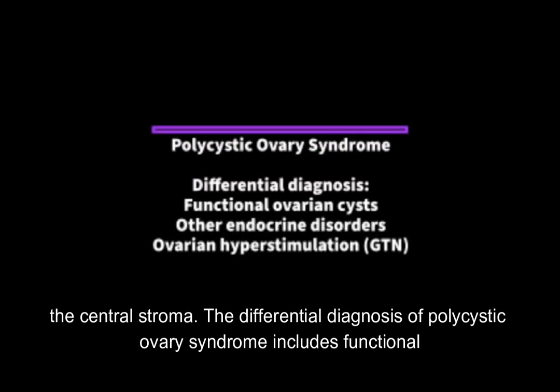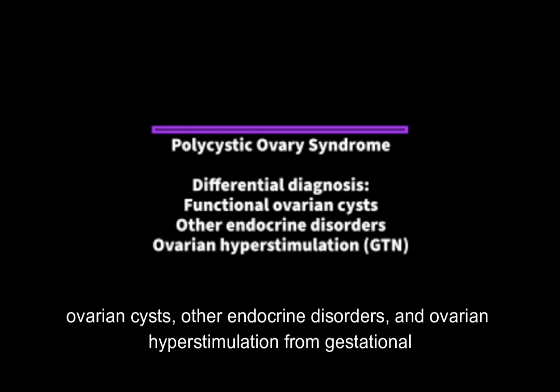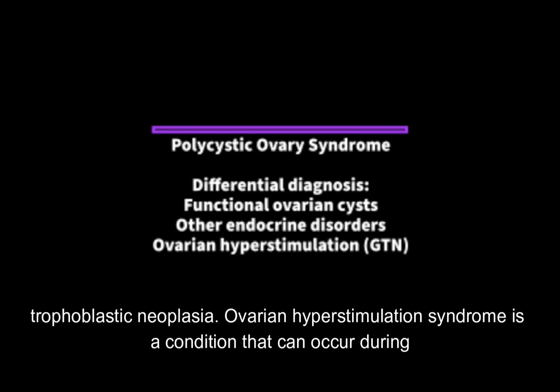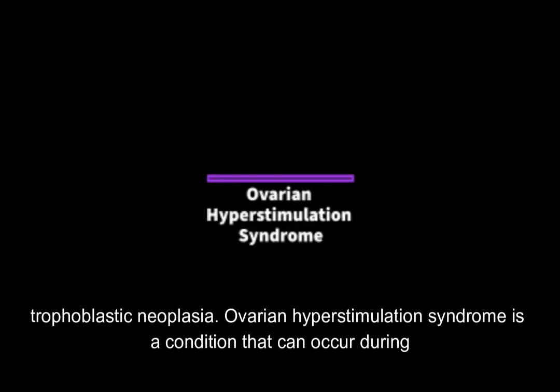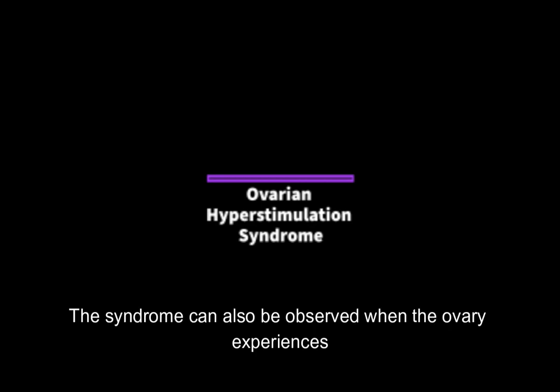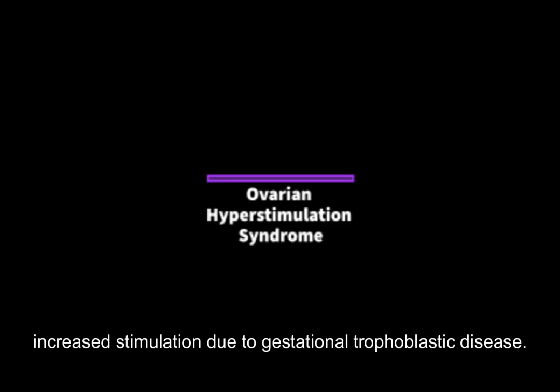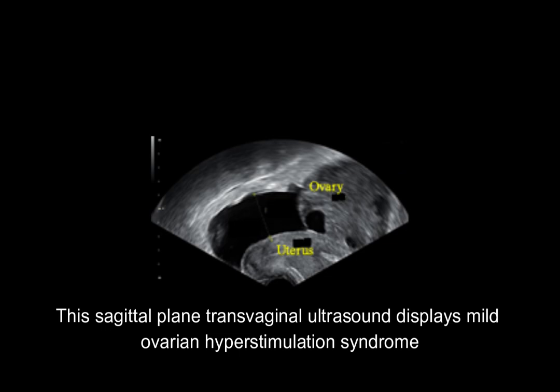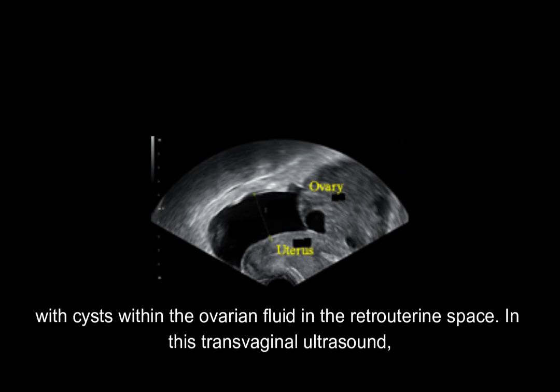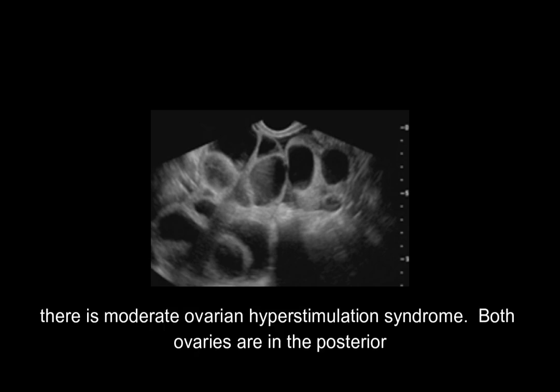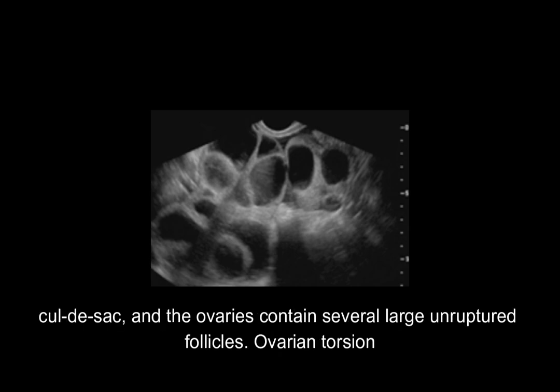The differential diagnosis of polycystic ovary syndrome includes functional ovarian cysts, other endocrine disorders, and ovarian hyperstimulation from gestational trophoblastic neoplasia. Ovarian hyperstimulation syndrome is a condition that can occur during infertility treatment when the ovary is excessively stimulated to induce ovulation, and can also be observed with gestational trophoblastic disease. A sagittal plane transvaginal ultrasound displays mild ovarian hyperstimulation syndrome with cysts within the ovary and fluid in the retrouterine space. In moderate ovarian hyperstimulation syndrome, both ovaries are in the posterior cul-de-sac and contain several large unruptured follicles.